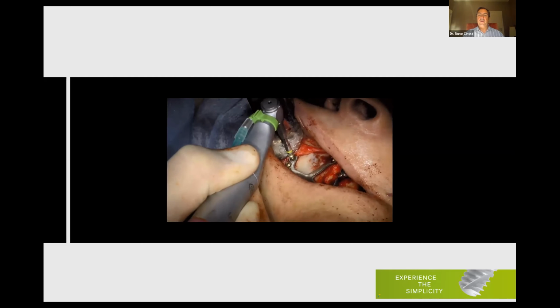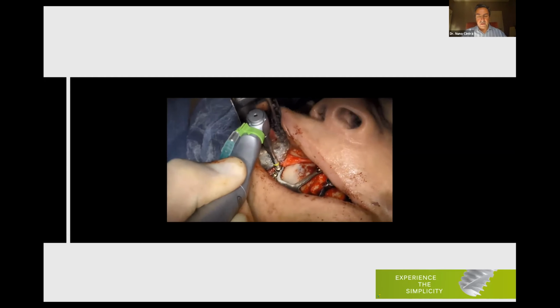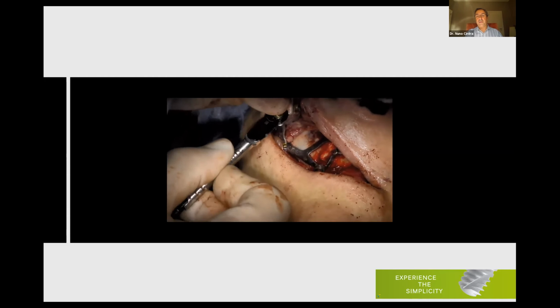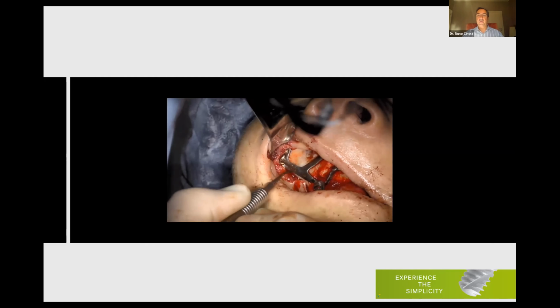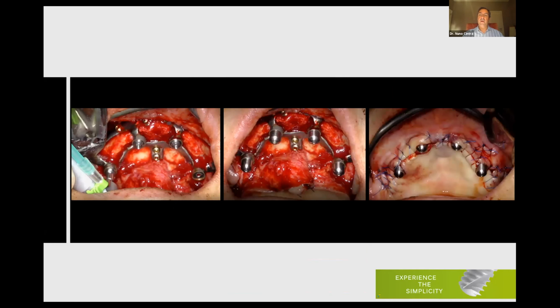So I usually use this key to place the screws, but after that I always check by hand if the screws are well tightened, and I always check that there are no gaps between the screws, the implant and the bone. If there is a gap, please fill it with any graft material, bone, or whatever you like. But this is very important. The custom implants have to be in perfect contact with bone, with no gaps between, because they can break, as I will show you.